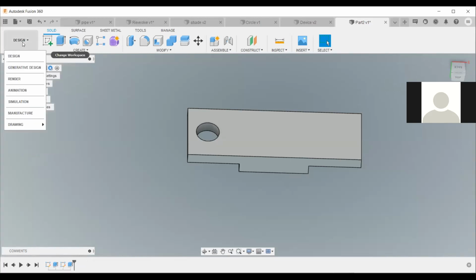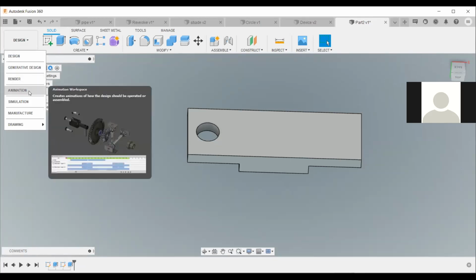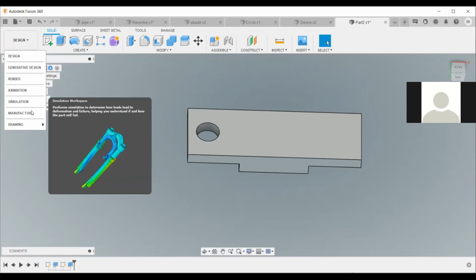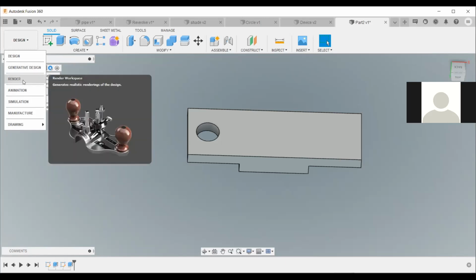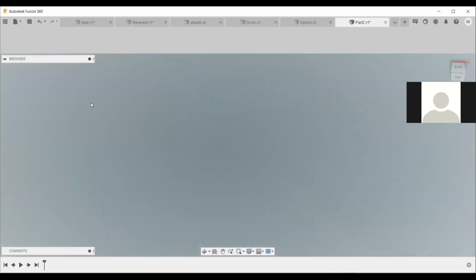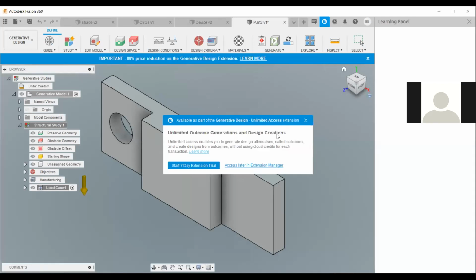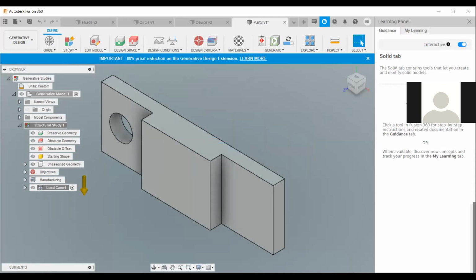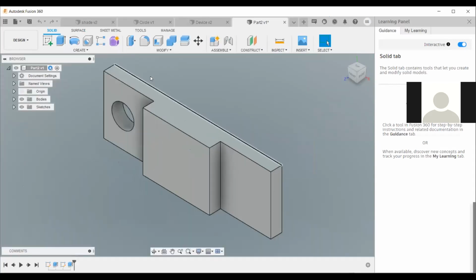It's just a, now it's not a design, but it is generative design. Yeah. So that is how you should create an assembly, simulation, manufacturing, drawing, animation, render, generative design. I don't know whether it's generative. It's not generative design. Just go back to design, and okay, yeah, you come here to assemble.